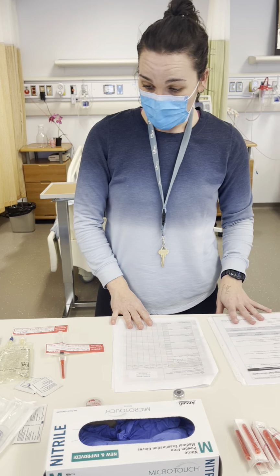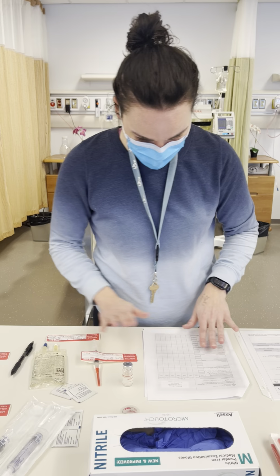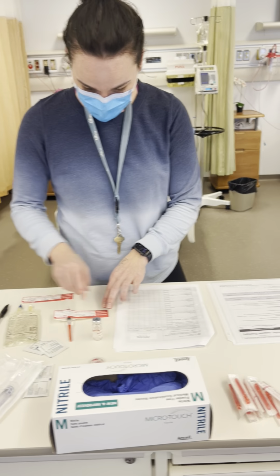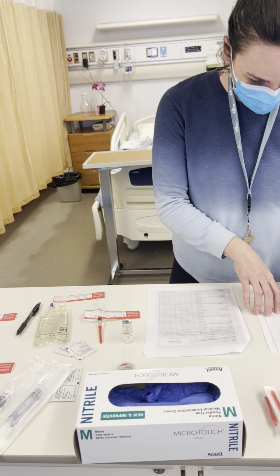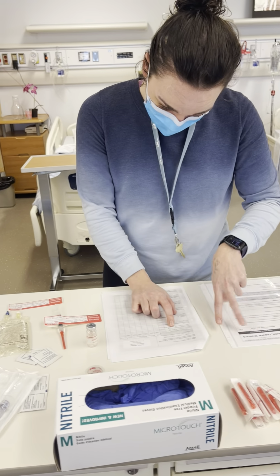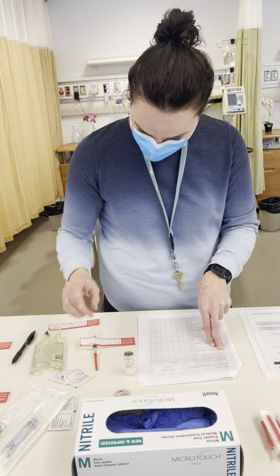Now we're going to do a check. We're going to compare all of our things here. So we've got right patient. So we've got our patient, Bryson Scotland. Okay, and he's receiving Humulin R. So we've got Humulin R here. That's what's ordered. That is what's in our vial.